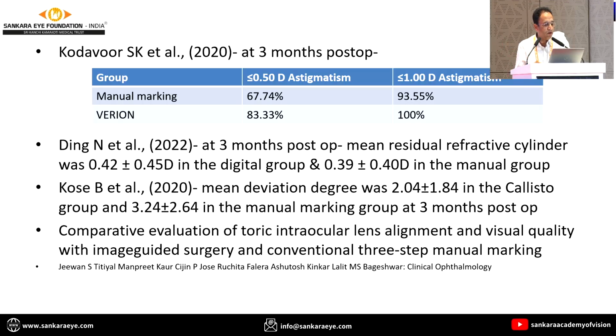So very well accepted. Another study was also there, and the one which is TTL, a comparative evaluation of the 3-step marking with the conventional, with the image guided surgeries. He also showed that the limitation of the study obviously was that they didn't take into consideration, they only took the rotation, not the residual refractive error. But even if you look at the rotation stability, it was comparable. So I guess people who want to do marking, with some experience, some trial, if you are able to get the correct ones, I think you will get more or less good results comparable to the image guided ones.